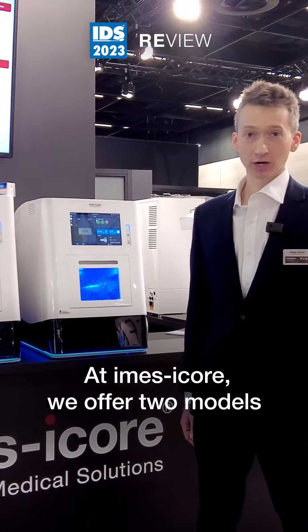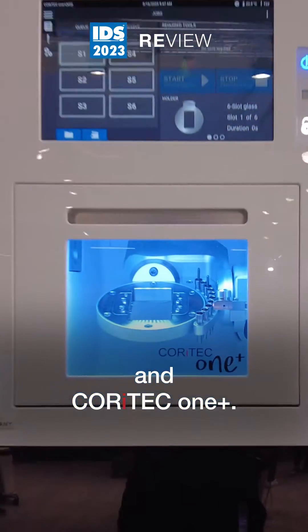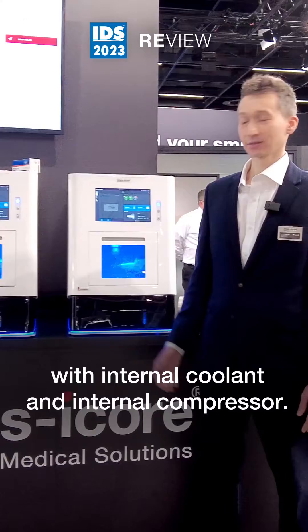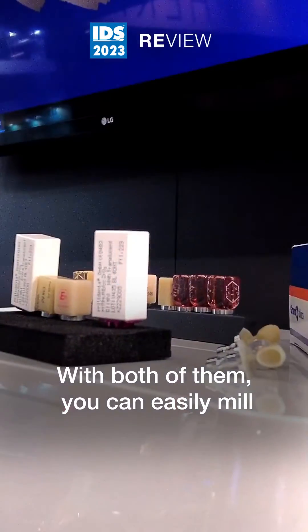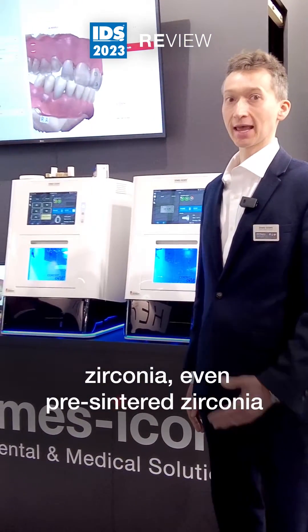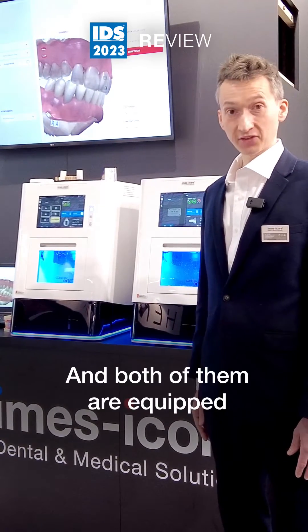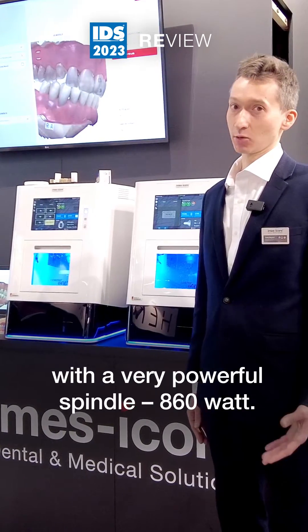At imes-icore we offer two models for chair-side: CORiTEC One and CORiTEC One+. With both of them you could mill wet and dry. Both are equipped with internal coolant and internal compressor. With both you can easily mill zirconia, even pre-sintered zirconia and full-sintered zirconia. You can mill ceramics, composite, PMMA — you name it. And both are equipped with a very powerful spindle: 860 watts.